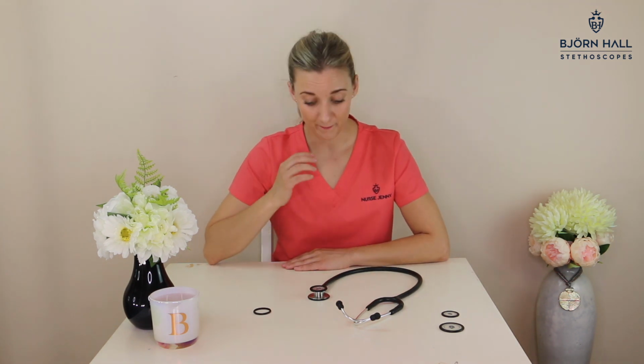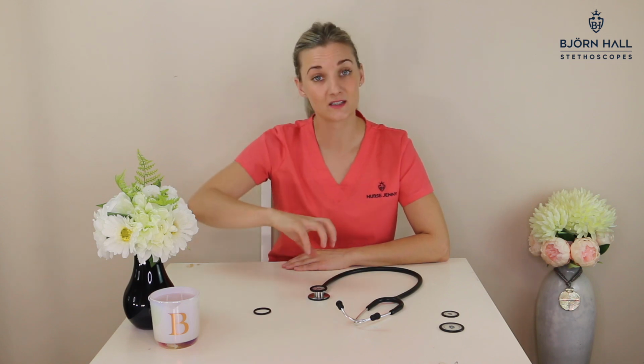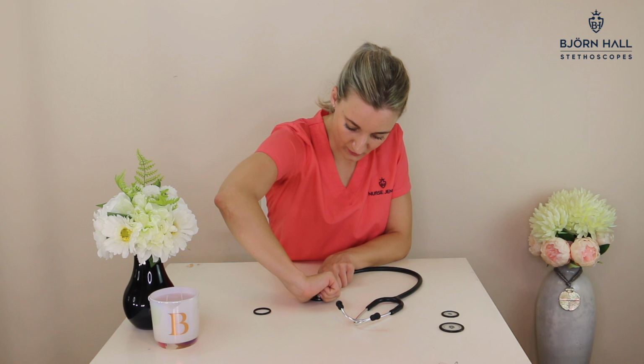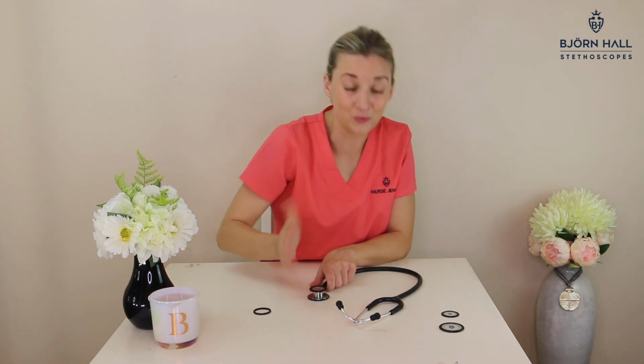There you go. Tip number 3, if you've managed to get your diaphragms on but they are crooked, you can always turn them and face the right way that you want them. So simply hold on to your chest piece and the tubing and put your fingers all the way around it, and turn until it is at the position that you would like it.